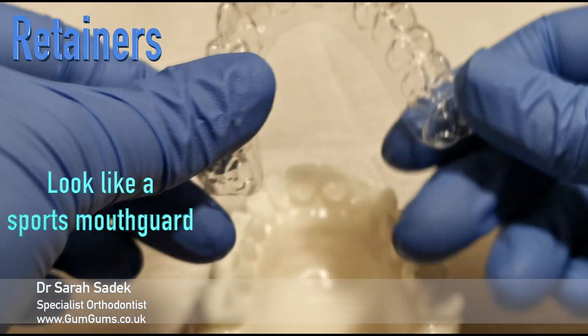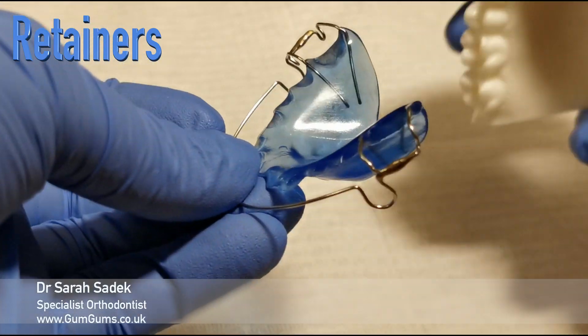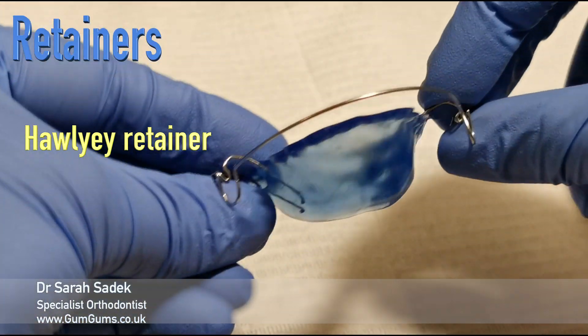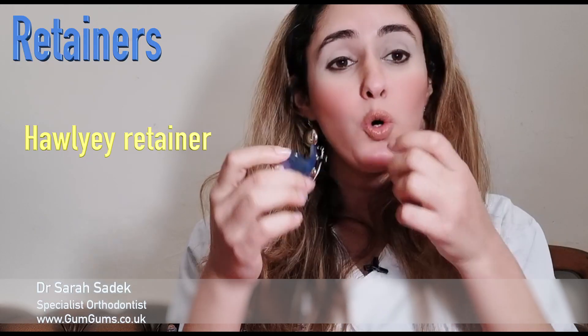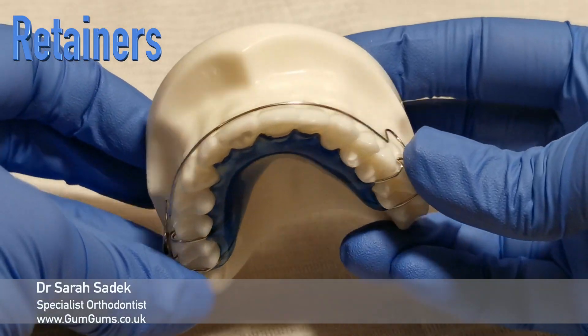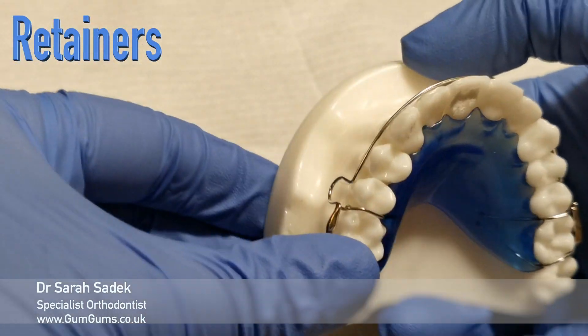The other type of retainer is a Hawley retainer, which looks like these. You may remember these if you've had braces before. They consist of a plastic plate that fits into your palate on your top teeth, or near your tongue on your bottom teeth. They also have a metal wire, which we call a bow, which runs around your front teeth and clips onto your back teeth.